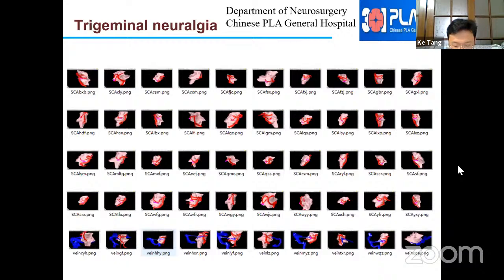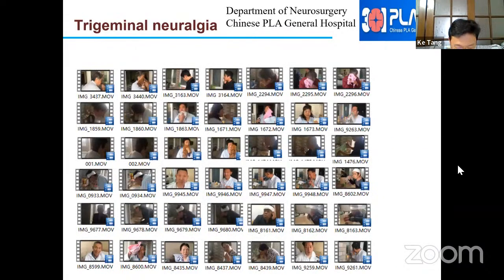The isocenter with high dose, such as 90 gray at 100% isodose line, should accurately reach the ideal site on the pain area of cranial nerve 5 to result in the appropriate level of axon degeneration. CT stereotaxis combined with multimodality imaging co-registration offers a combination of geometric accuracy of CT and the satisfactory anatomic identification of MRI. It contributes to the outcome of Gamma Knife for treatment of trigeminal neuralgia.